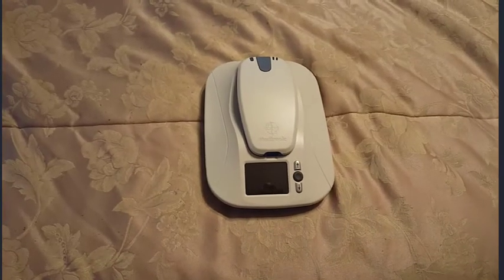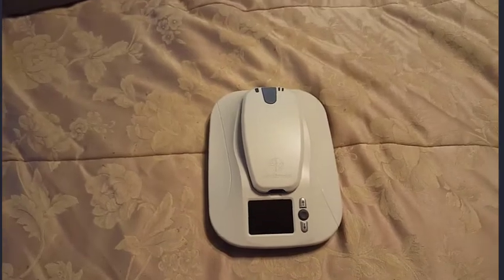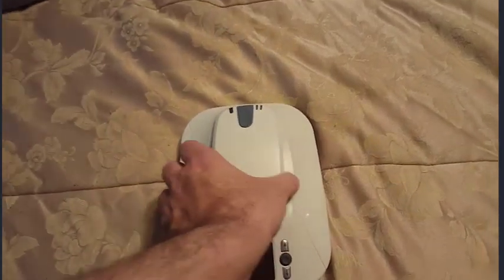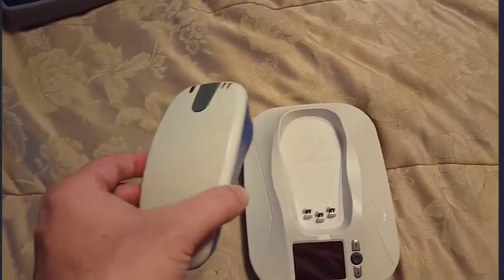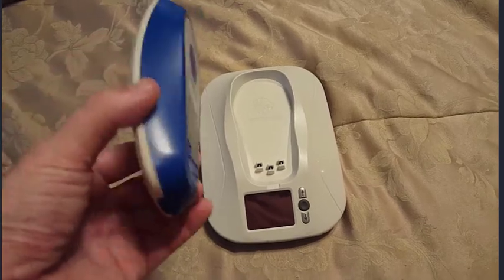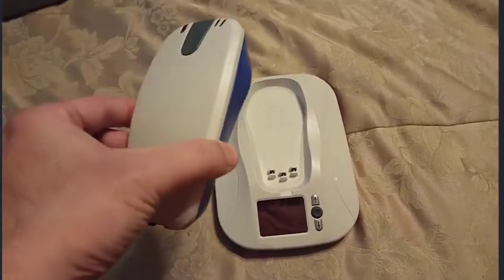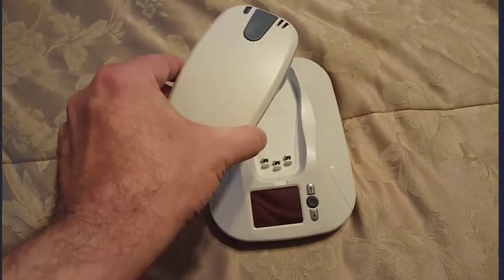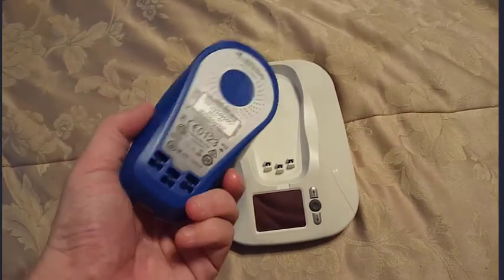But with my new ICD, I will now use this device. And this one will work a little bit differently. This one will stay plugged in 24 hours a day constantly by my bedside. And it will monitor my device whenever I am near it. So it will collect data all the time. And I can use this part of it for regularly scheduled EKGs to my doctor's office.